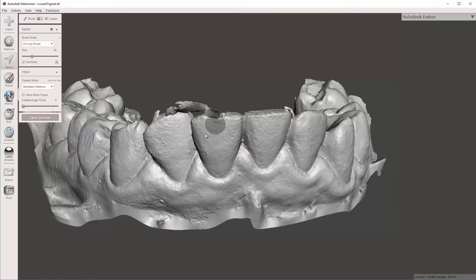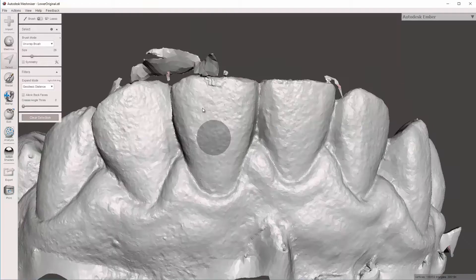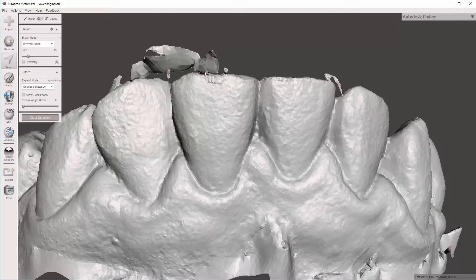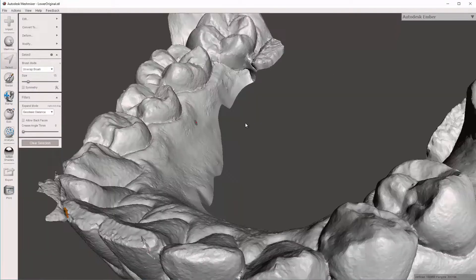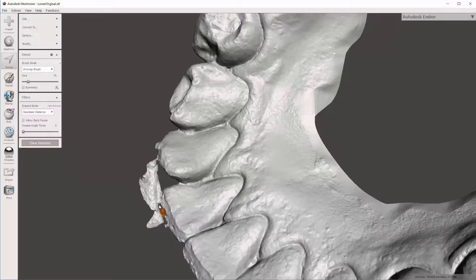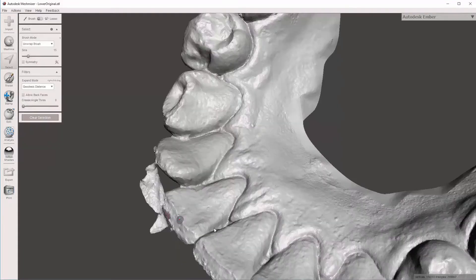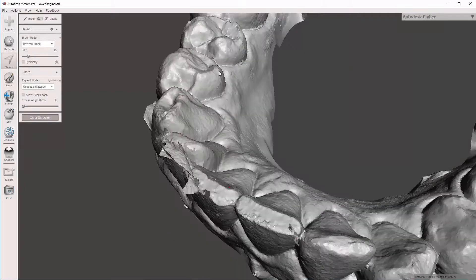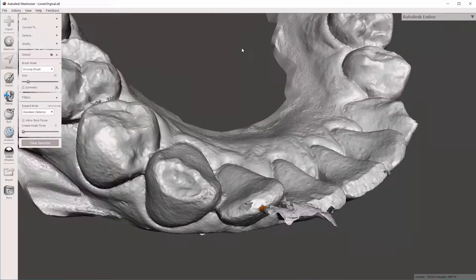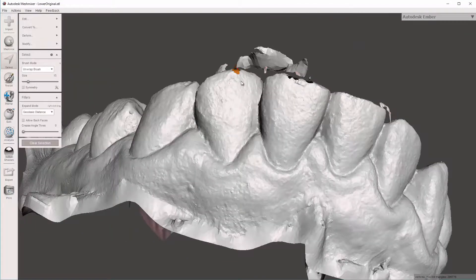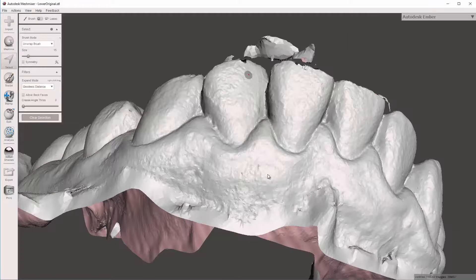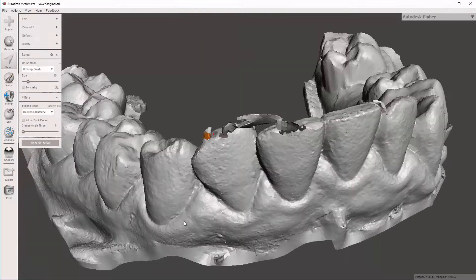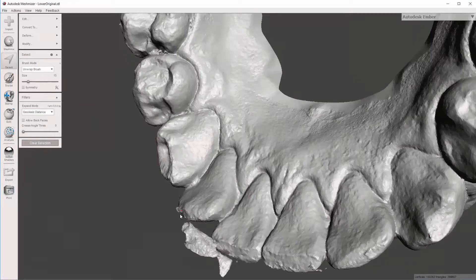Hit S. And now, another way to do it is actually to make your selection area much, much smaller, and just select right at the base. We don't actually need to select the top area, and I'll show you why in a moment. But if we make it so that if I hit Delete, it's no longer connected, that'll work. Delete. That little guy's just floating off in there. And this looks fairly well removed. Yep, it's floating there.